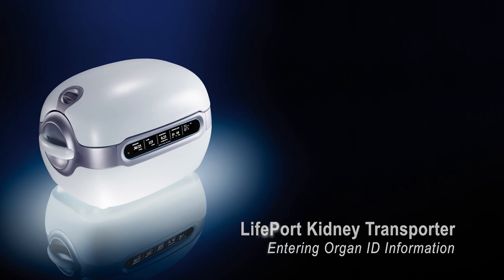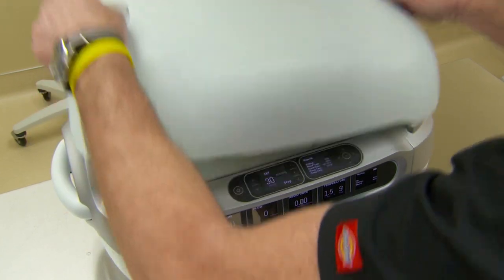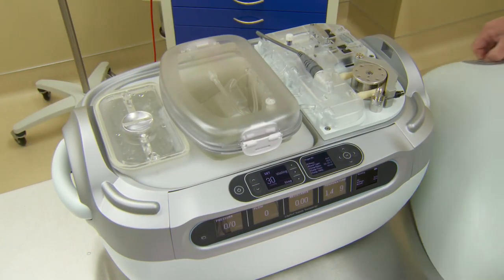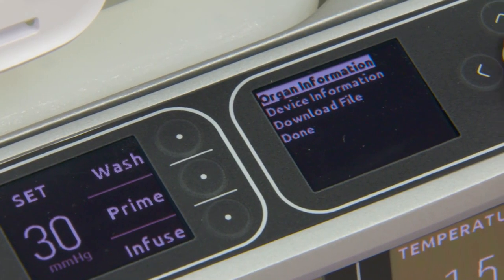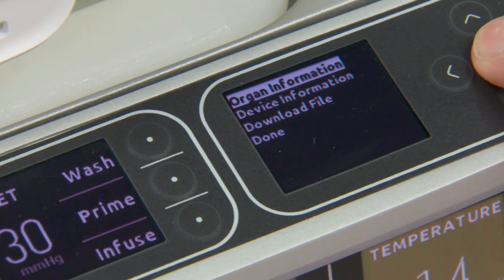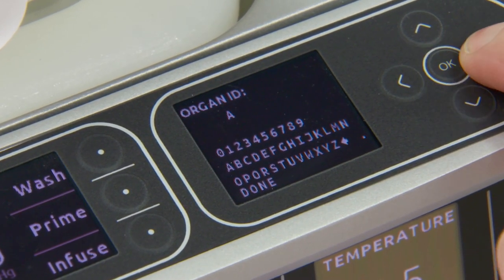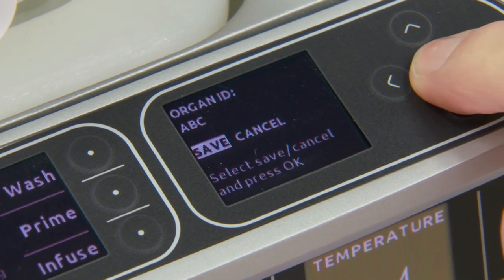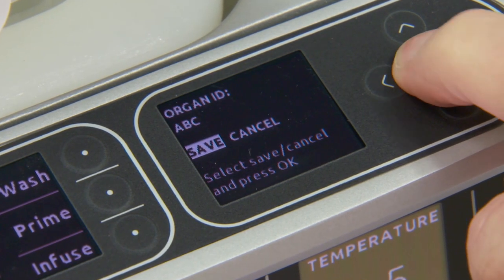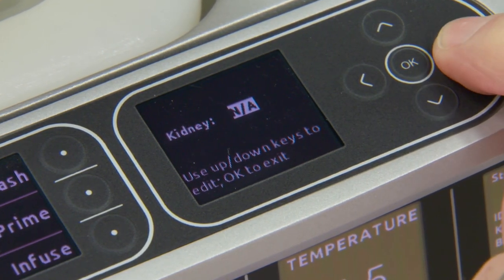Entering organ ID information on the Lifeport Kidney Transporter. Start by accessing the control panel on the top of the Lifeport Kidney Transporter. On the right-hand side, you will find the five-way keypad. Pressing OK will populate a menu. Once populated, select Organ Information and click OK. Enter your UNOS number. Once completed, press Done. The unit will ask you if you'd like to save or to cancel — this is your opportunity to confirm your work. Do this for each of the items listed.